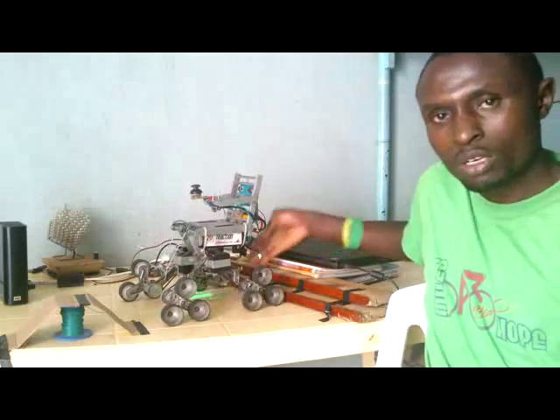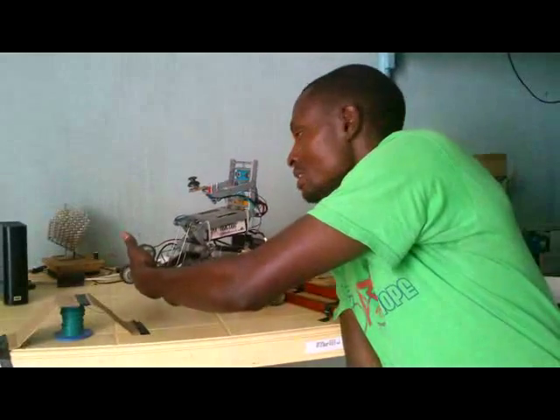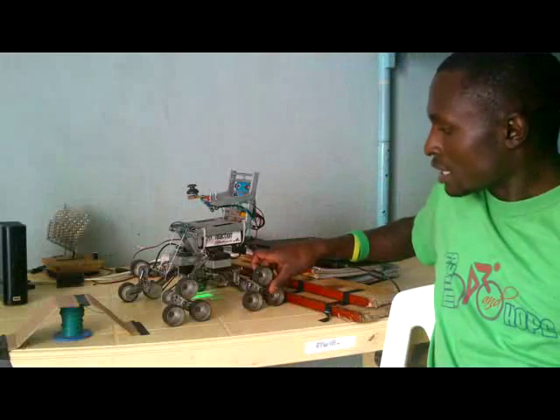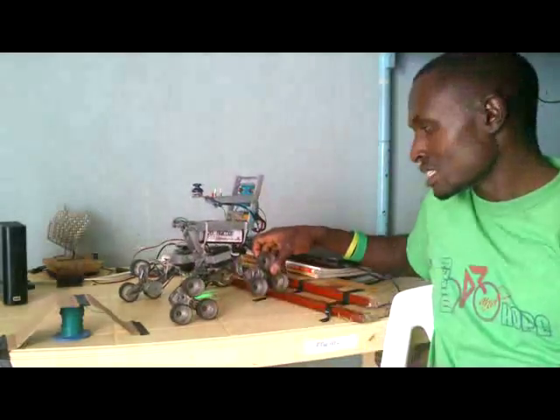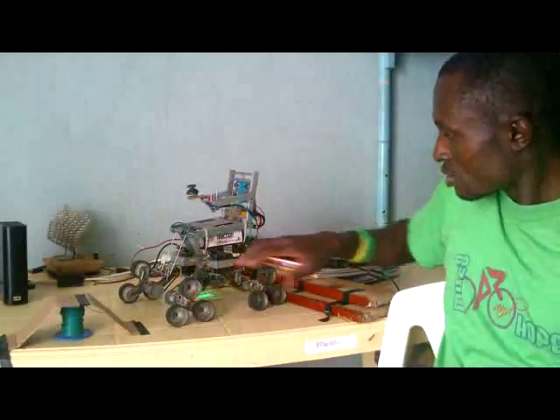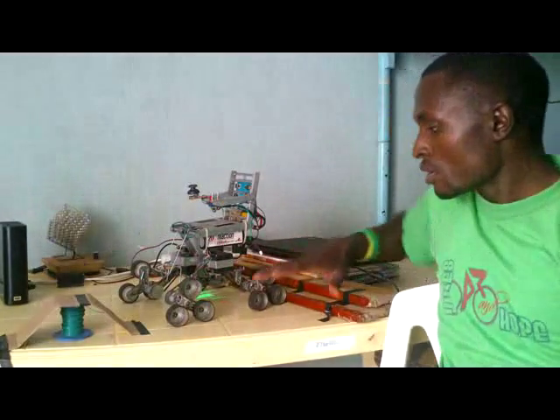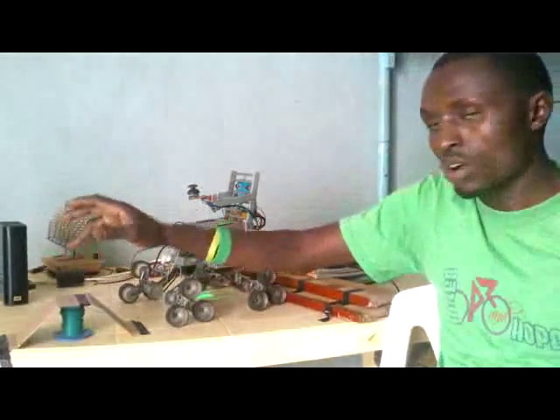It has an onboard microcontroller that is controlling the balancing of the seat, plus actuators, that's the servo. Again, the chassis can twist. You can notice that the seat is auto balancing automatically. So I've tried to create the environment whereby you have the stairs, you have the smooth ground, and you have rough terrain to go up.